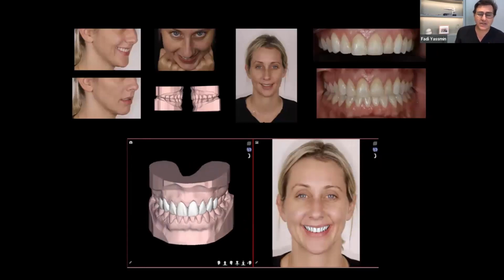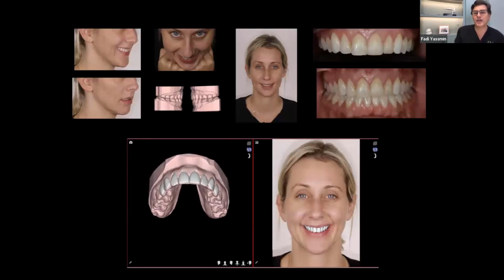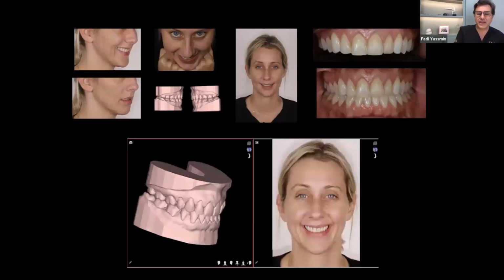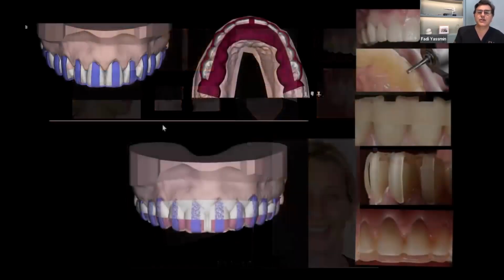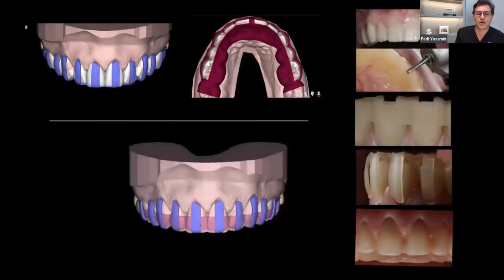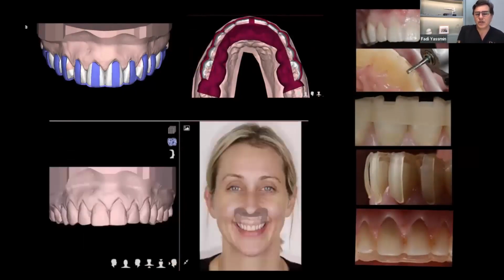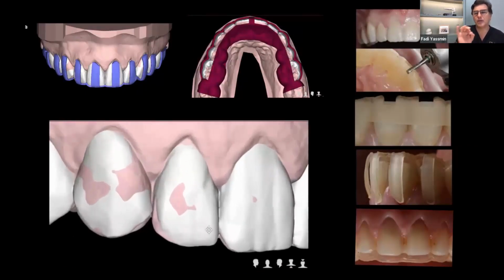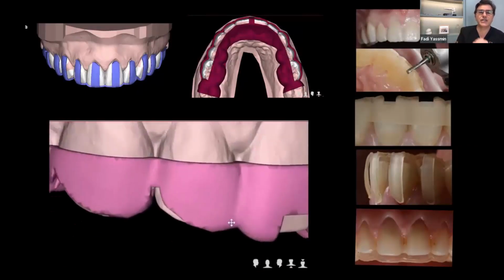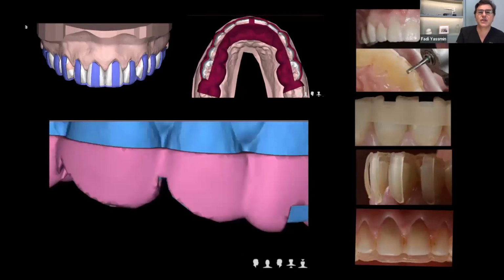But again, this patient came in absolutely mortified, worried that if her veneers weren't natural, what would they look like? And we assured her in terms of the process, what is actually done. So not only was the mock-up a confirmation for her, but we showed her what we do in terms of very specific reductions.